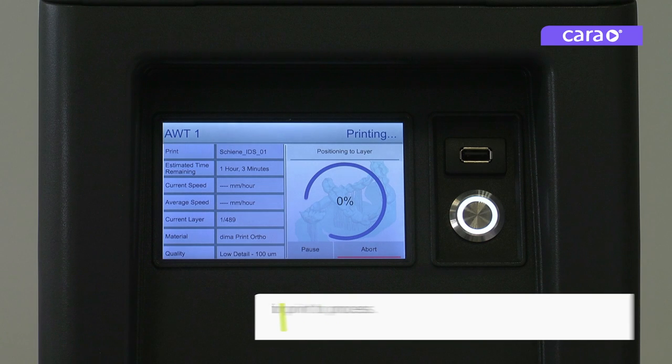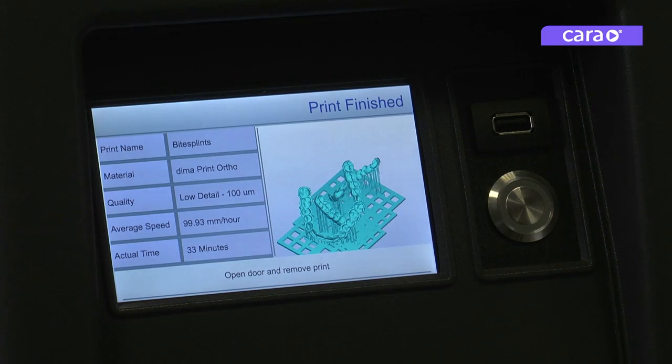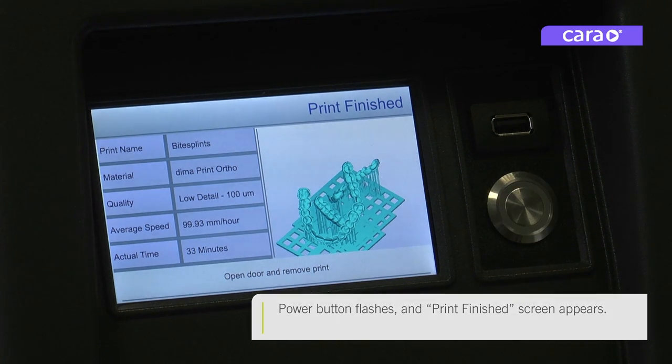Please wait for the print to process. When the print is complete, the power button will flash and the print finished screen will appear.